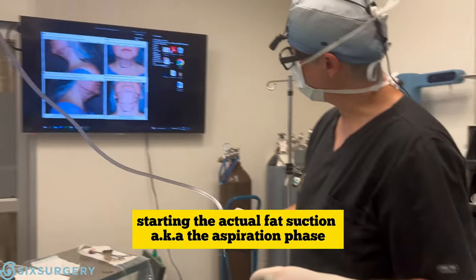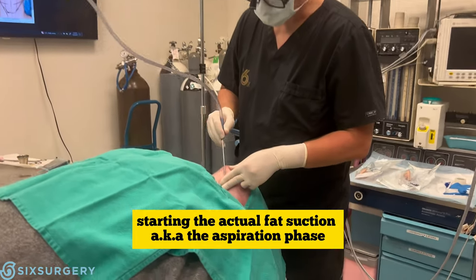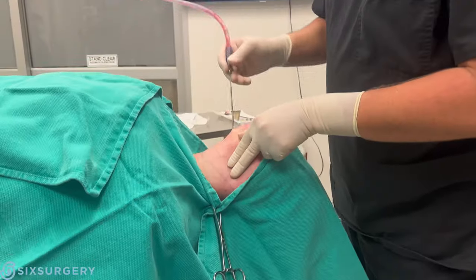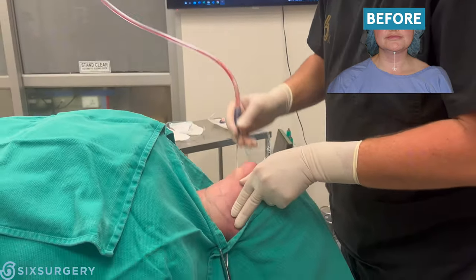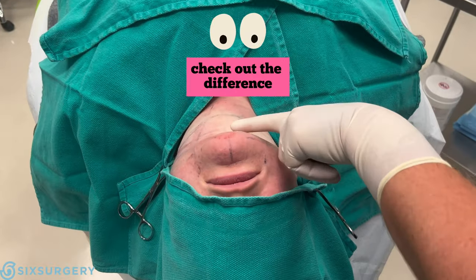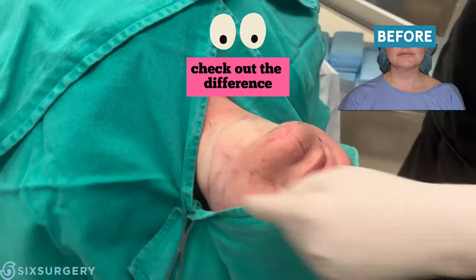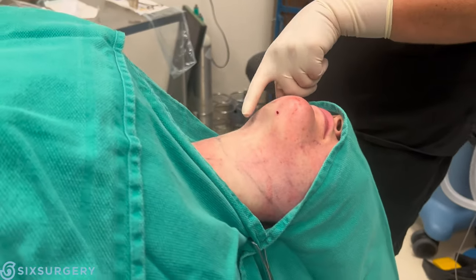So we've injected the tumescence with epinephrine and gave it a few minutes to work. Now I'm going to start liposuction using a very, very fine cannula — this is what I do for necks. The goal here is not large volume; this is about shaping, not debulking. Her neck is not that big — it's really just to create some nice shape and contour. I've done the right side and I've defined the jawline here — this side is now empty, this side is still full. There's a tremendous difference I can see between the two sides.